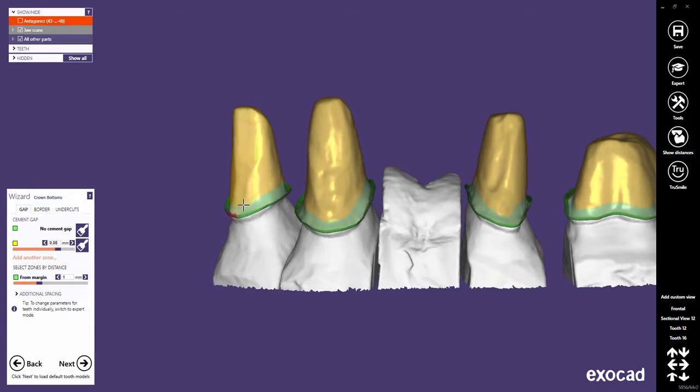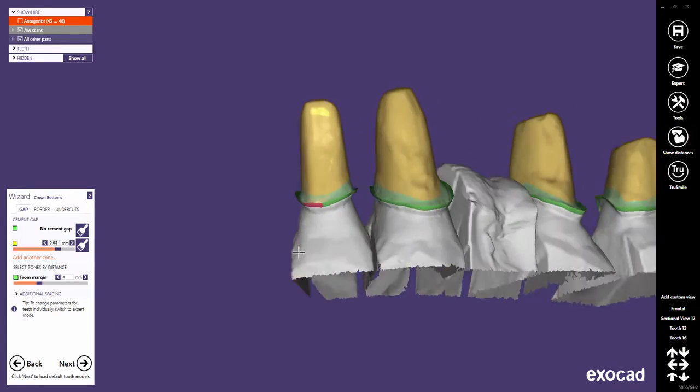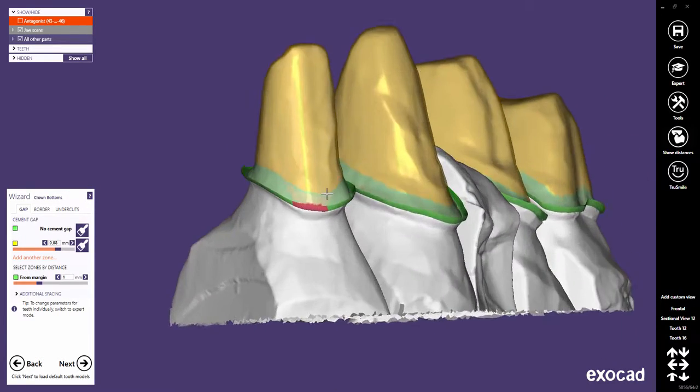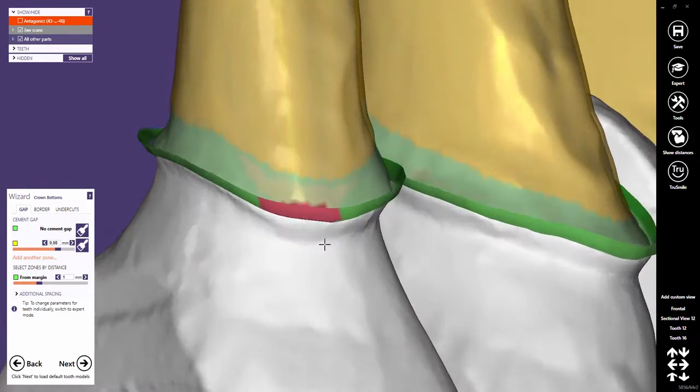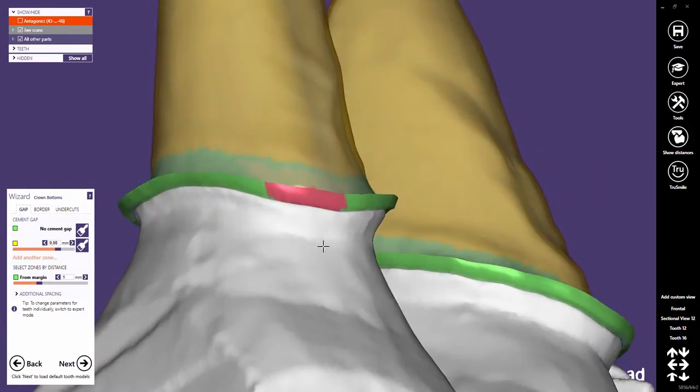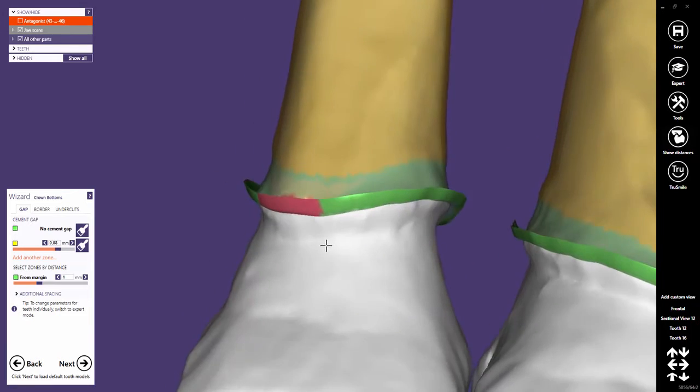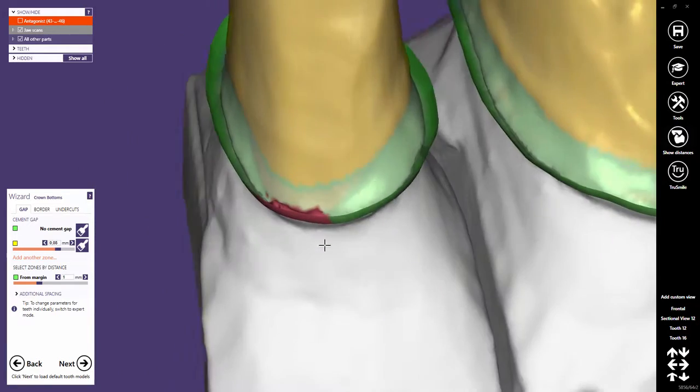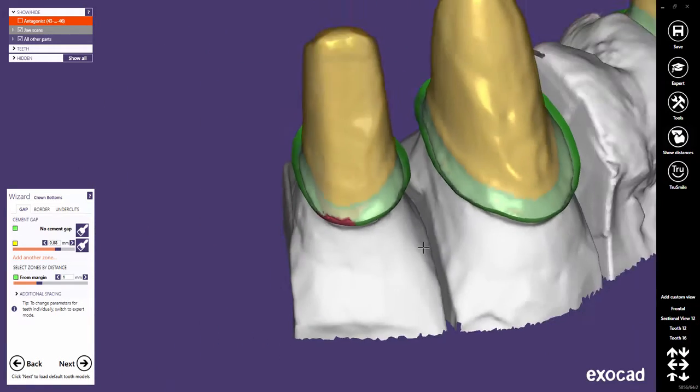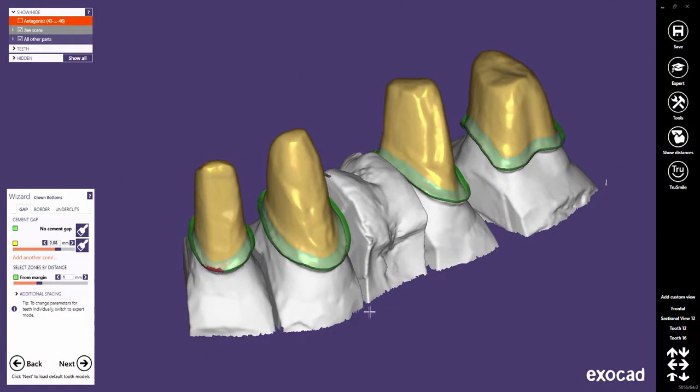The red zones on the margin indicate areas which might create undercuts. This behavior can be changed in the Undercuts tab, which will be explained later in this video.